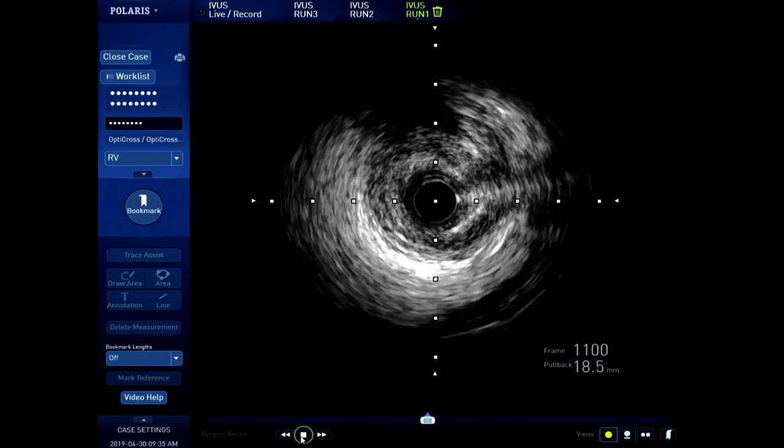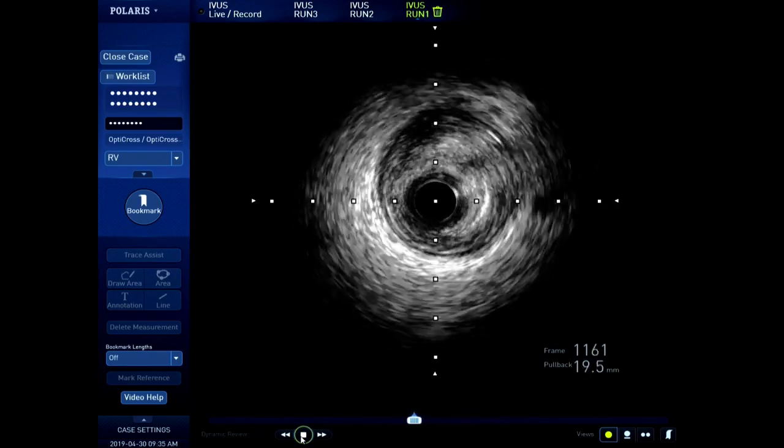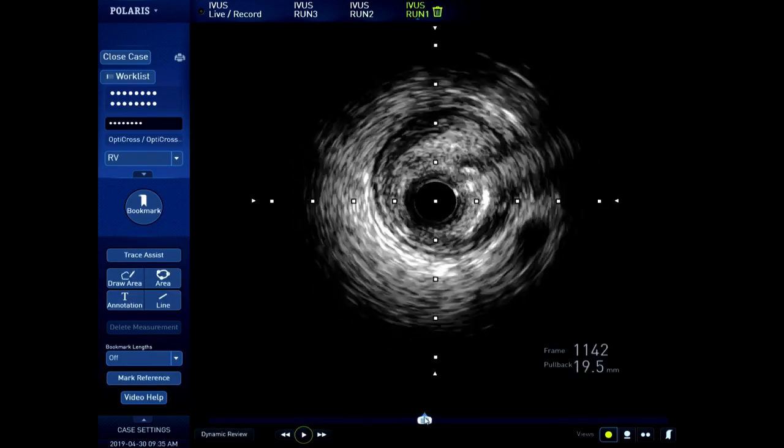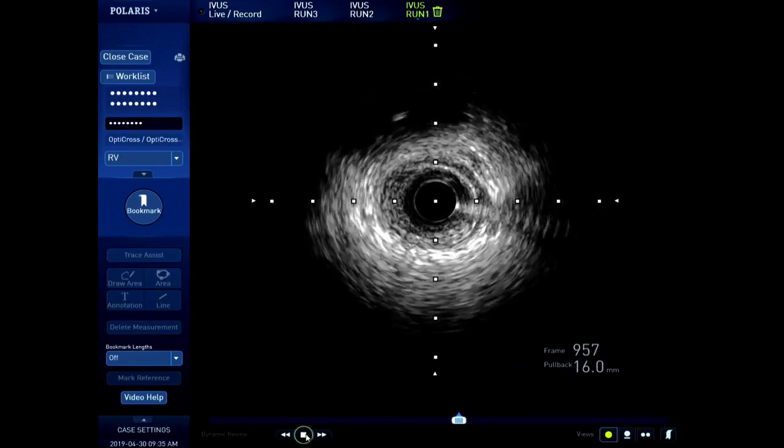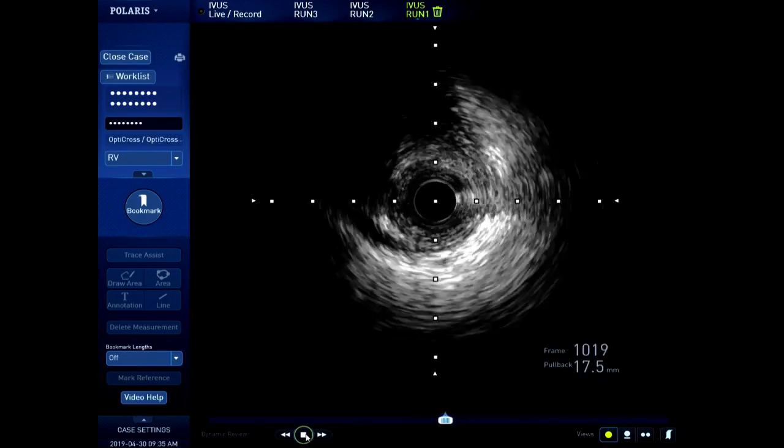There is a small channel entering there. So which wire is your first choice then, Dr. Asakura?